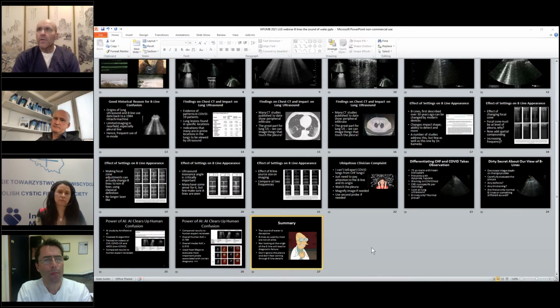So using one of the lung ultrasound scores, I'm personally a fan of using about 12 zones total for the lung exam, so 6, 3 front, 3 back. And I think even if you're the only person doing it, it's a bad idea to try to keep it in your mind, because if you're busy enough, like during times of COVID, you can forget. Did this patient have lesions here before or just lower?